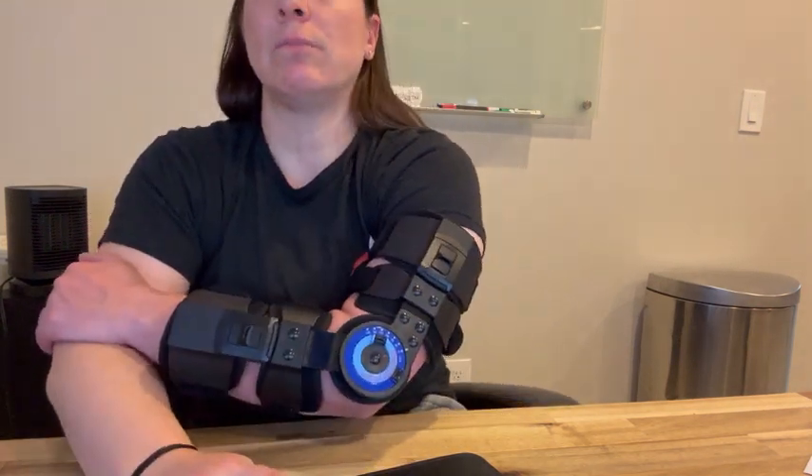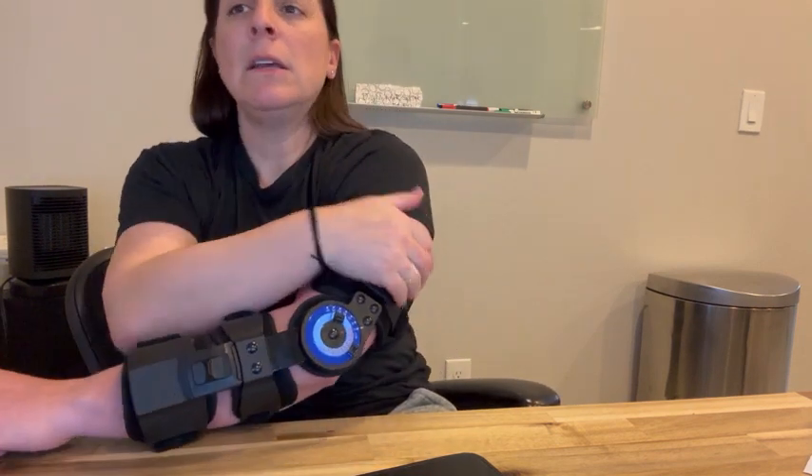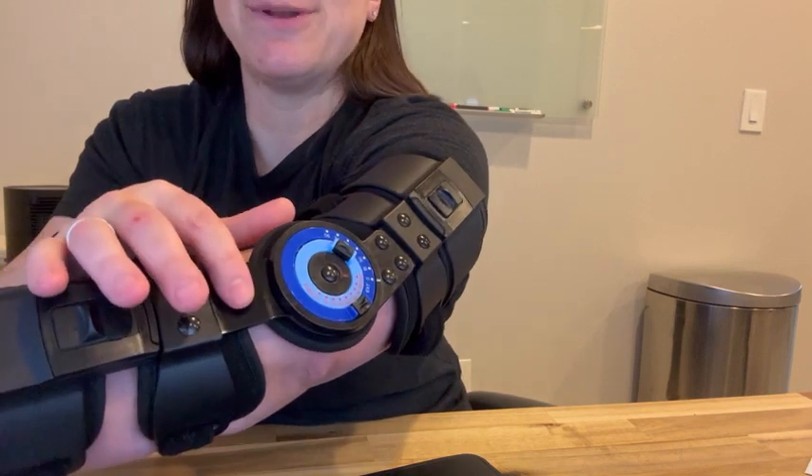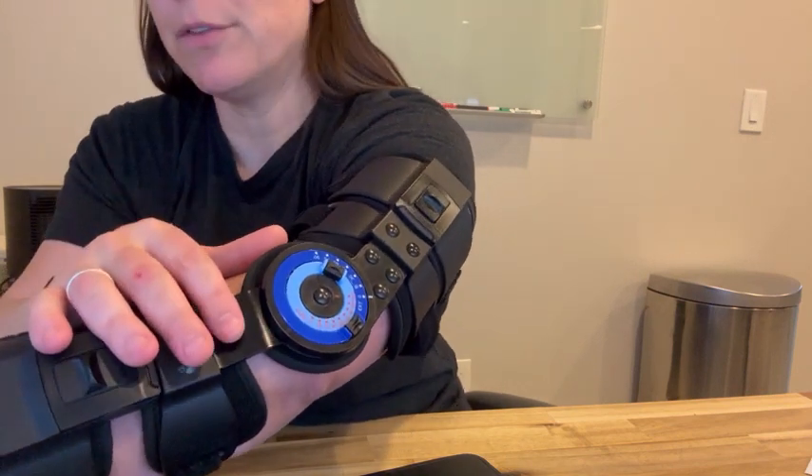It has lockers, which is really terrific, and an adjustable hinge, which is also really ideal. It's a plastic shell with an adjustable chuck, and it has aluminum alloy support bars.